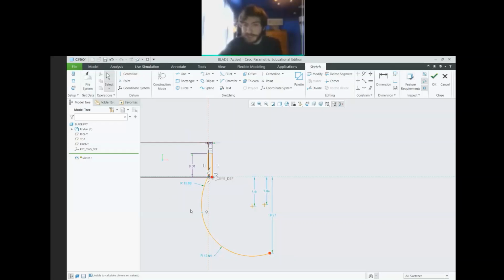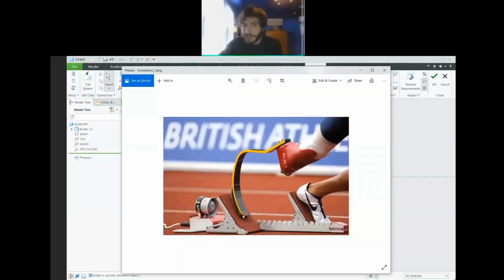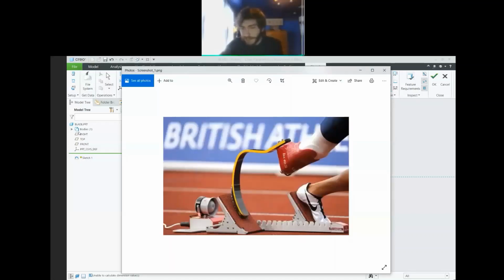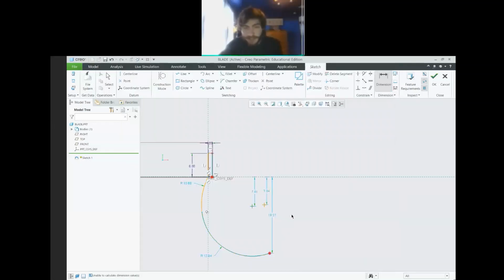All right, so the next thing, the only other dimension we would know in this case, is probably this top to bottom dimension. We would know how big this thing is. So we can go over here to our dimension tool. We can click this top point, and that'll be our bottom point. Click the two, middle mouse button, click somewhere between them vertically, and you'll get this dimension.